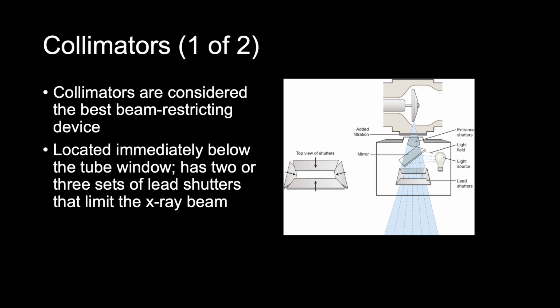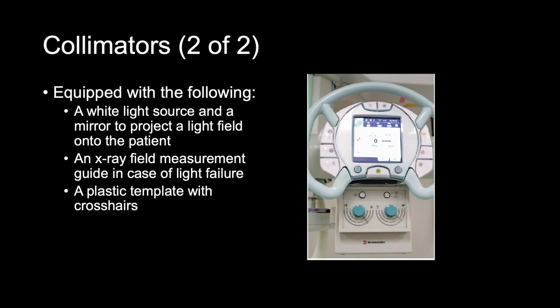The field shape produced by a collimator is always rectangular or square unless using a lead mask, cone, or a cylinder placed below the collimator. A lead mask is similar to an aperture diaphragm in that it will change the shape and size of the projected X-ray field.